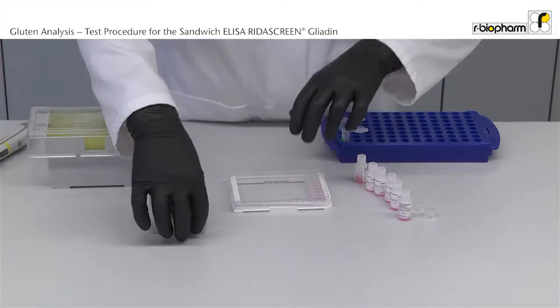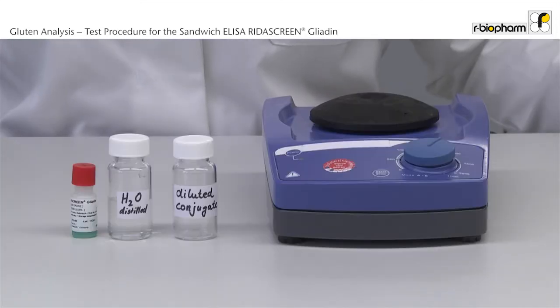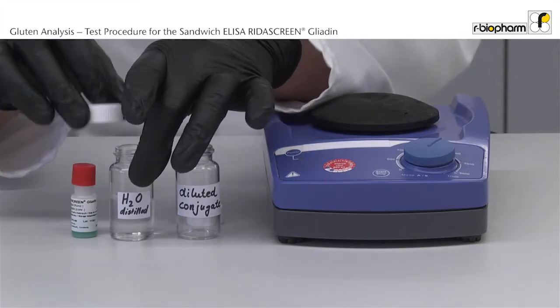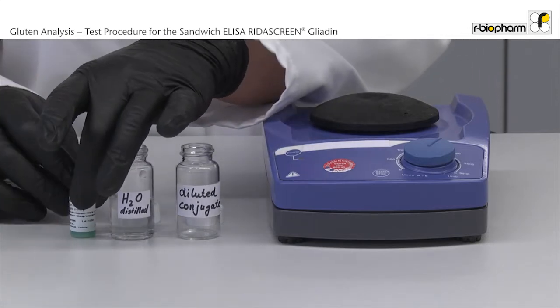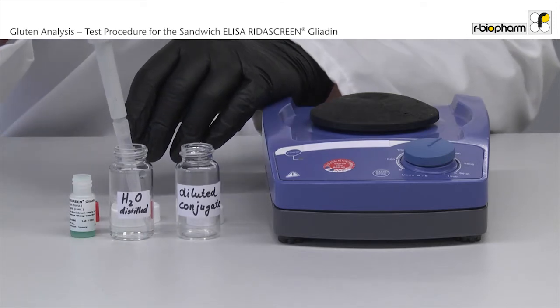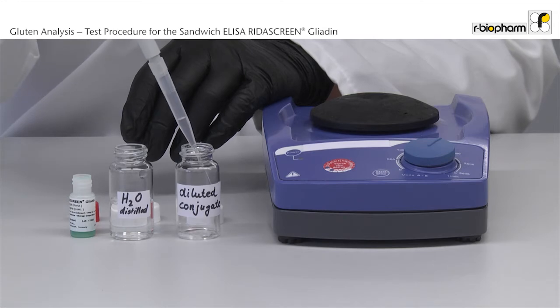Incubate for 30 minutes at room temperature. During the incubation time the conjugate is diluted 1 to 11. Add 200 µl concentrate to 2 ml distilled water and mix gently manually.